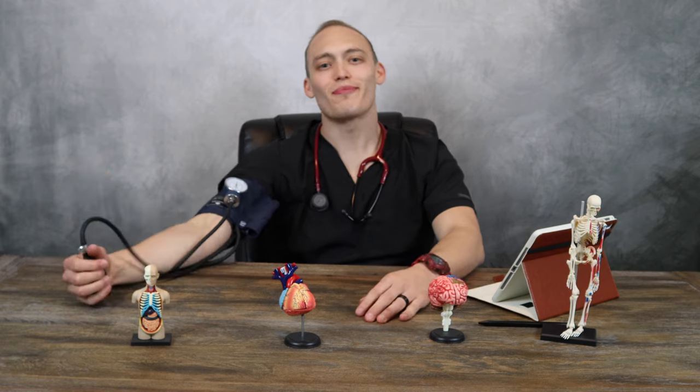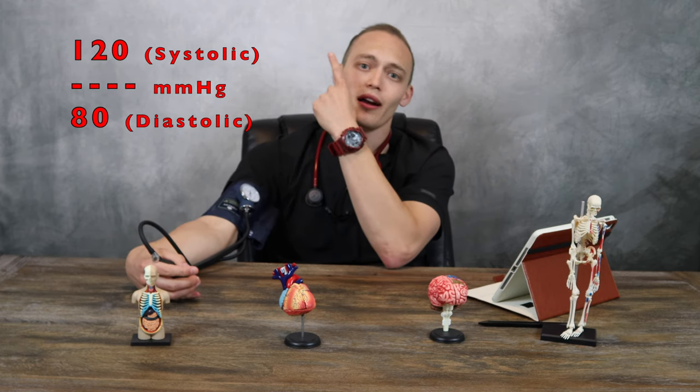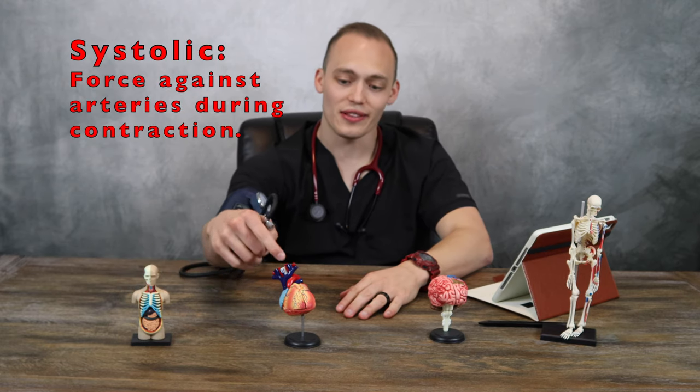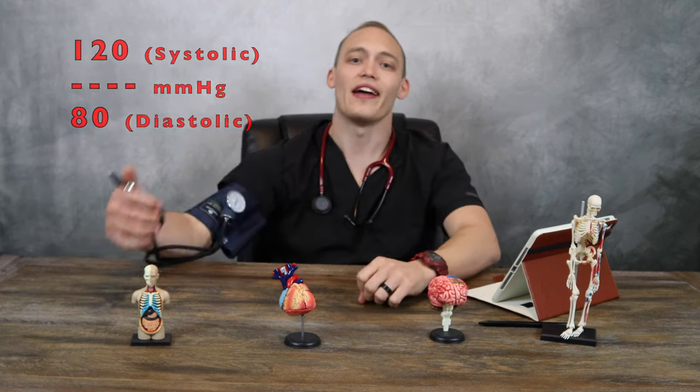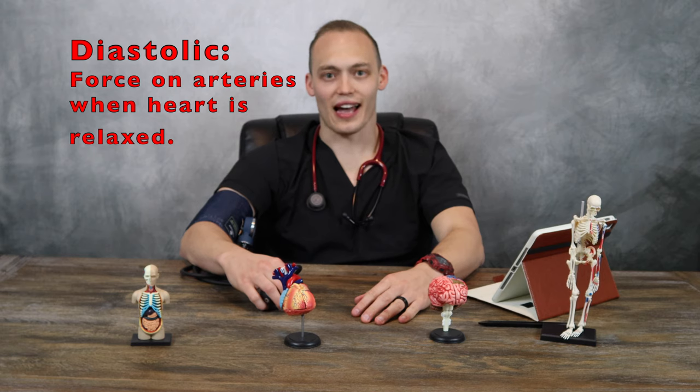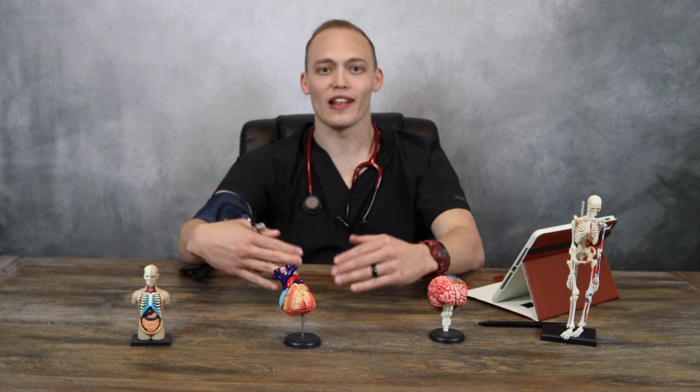After heart rate and respiratory rate, I like to move to blood pressure. Blood pressure measures the force of your heart against the arteries when it contracts. There are two numbers: the top number is systolic — the force against the arteries when the heart contracts — and the bottom number is diastolic — the force against the arteries when the heart is relaxed. Blood pressure is measured in millimeters of mercury. The American Heart Association recommends 120 over 80 or less as ideal.